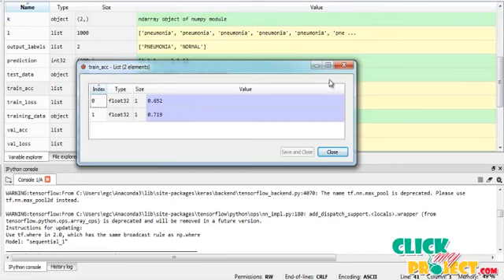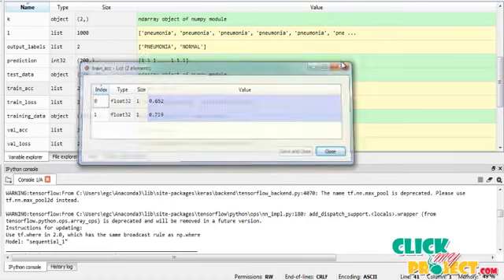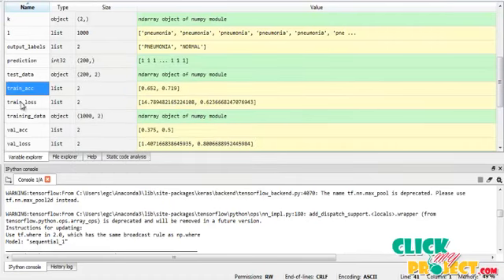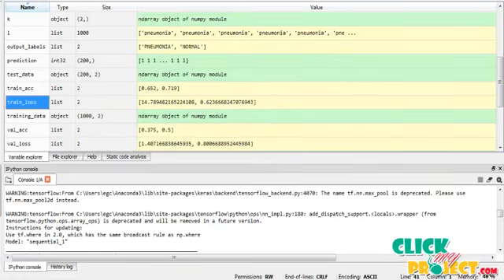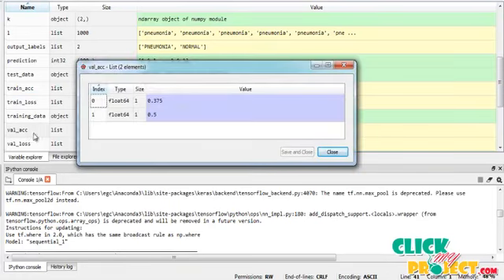This is the training accuracy of the model. This is the training loss of the model. This is the validation accuracy of the model.